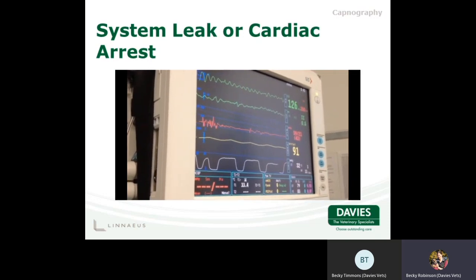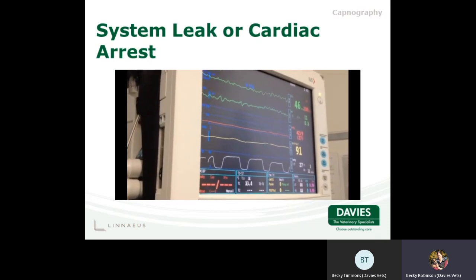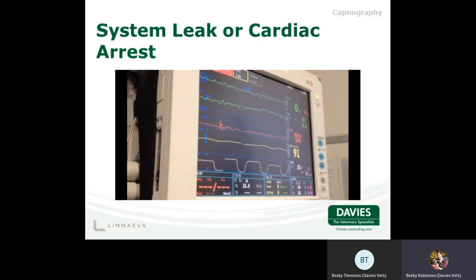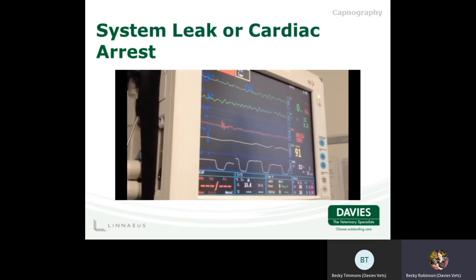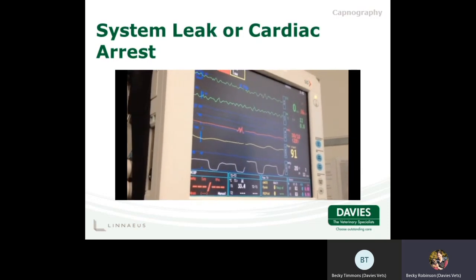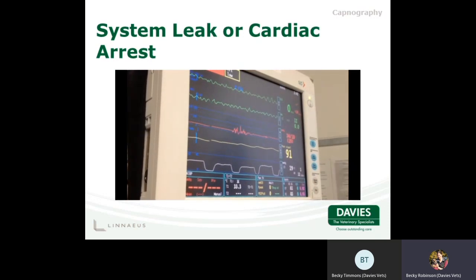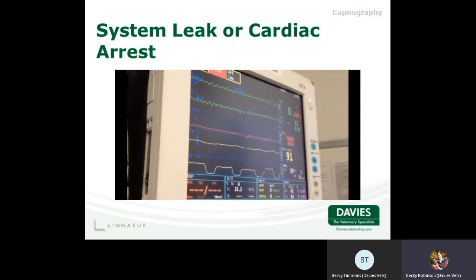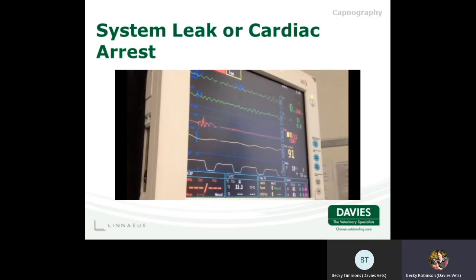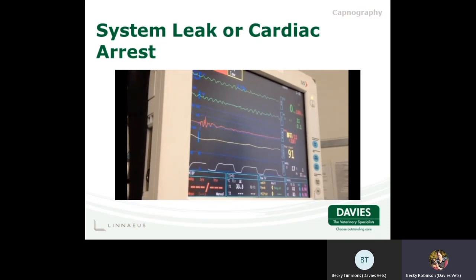But watch what happens with the patient's capnograph trace. This patient is being mechanically ventilated throughout the euthanasia. The euthanasia of this horse is obviously under anaesthesia, but we can see that the capnograph trace is decreasing over time, because as there is decreased circulation, as the patient has gone into a cardiac arrest, there is a decrease in the amplitude of the trace of our capnograph.